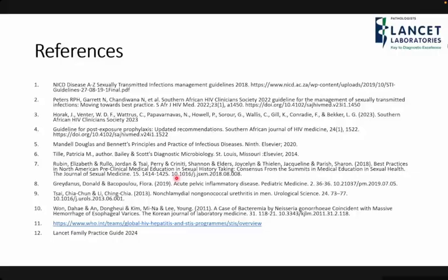And in state, as far as I know, since I left state in 2021, they don't have any molecular assays for STIs. So that's why you always use a dry swab, because they do cultures.